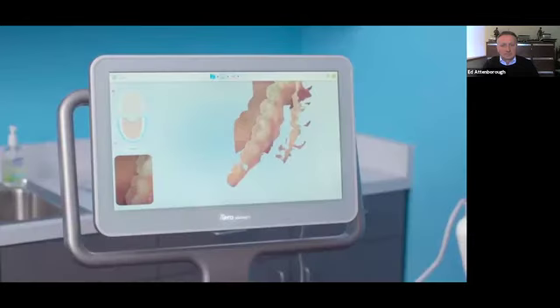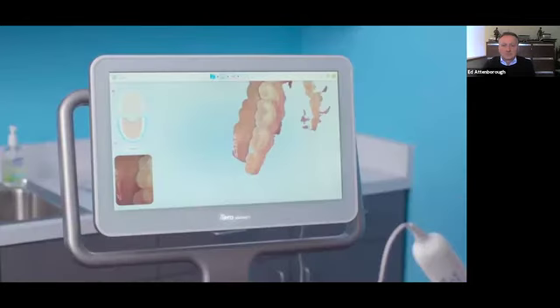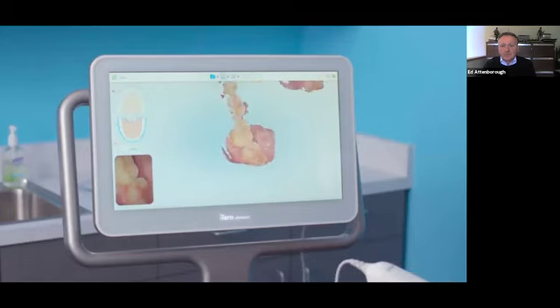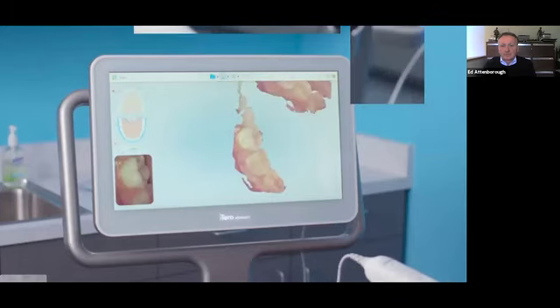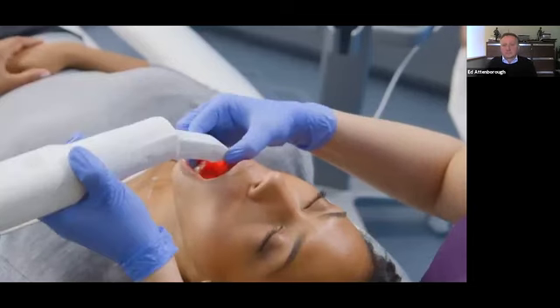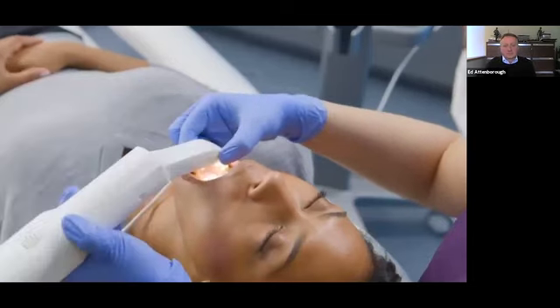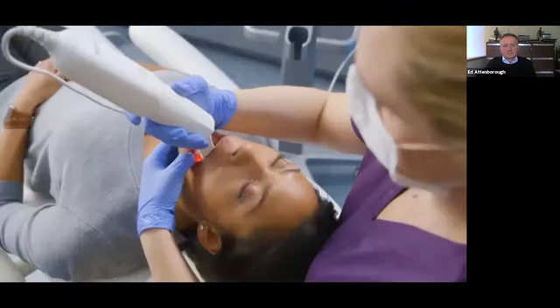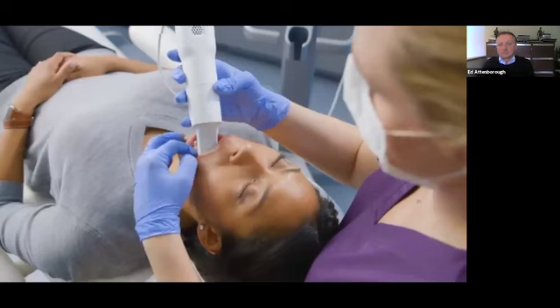I'm always careful to roll over the occlusal of the terminal tooth when I'm moving from the lingual to the buccal. This ensures that the model builds smoothly. While scanning the buccal surfaces, I orient the tip of the wand at a 45-degree angle to the buccal surface, with the cord end facing away from the patient. I follow the arch with the wand as I move toward the anterior.